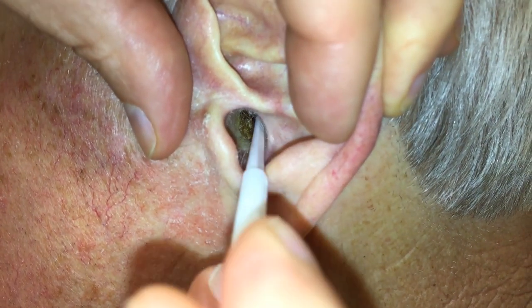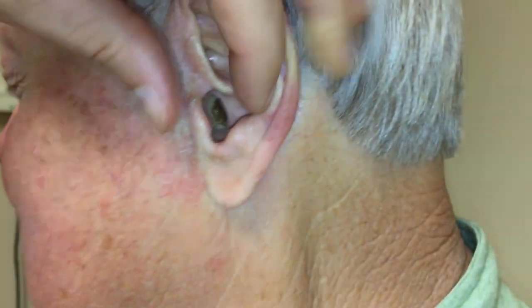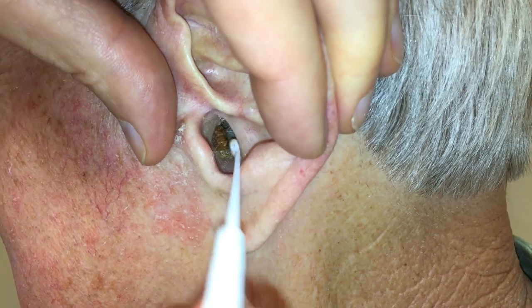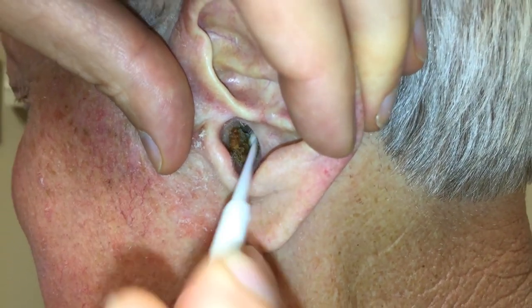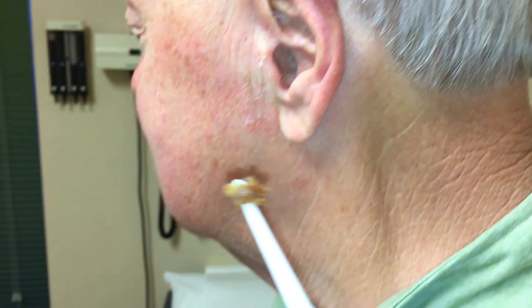Glenn, are you okay with this? Yes. Because that's pretty hard stuff. Oh yeah, I knew it was hard.